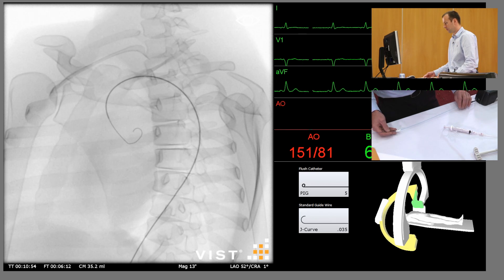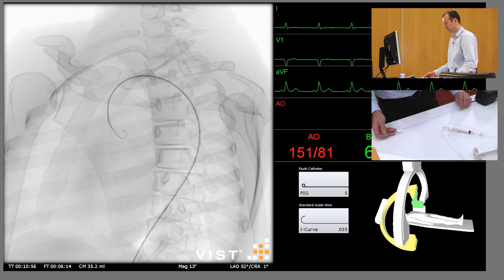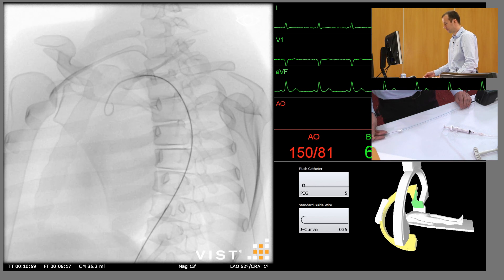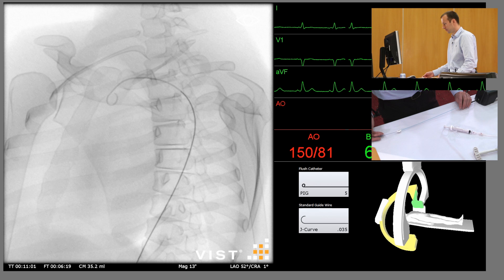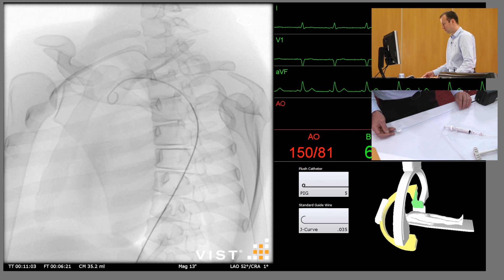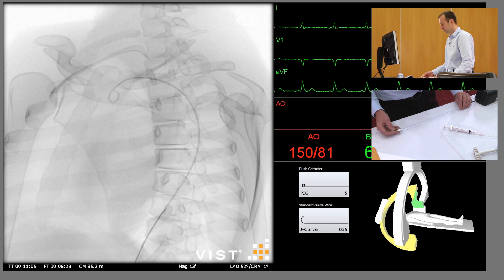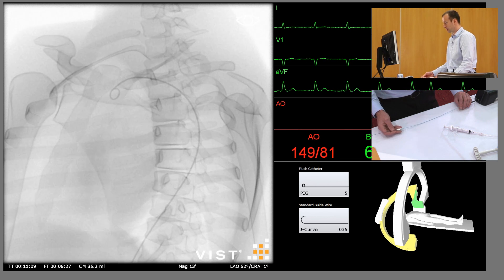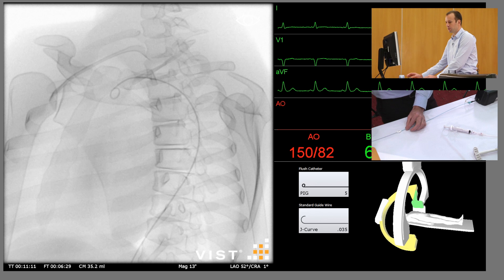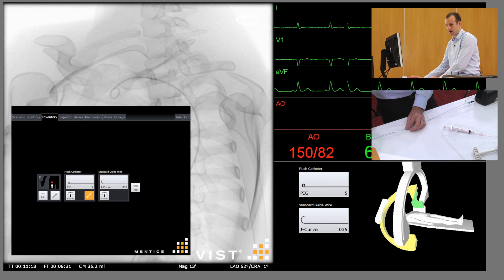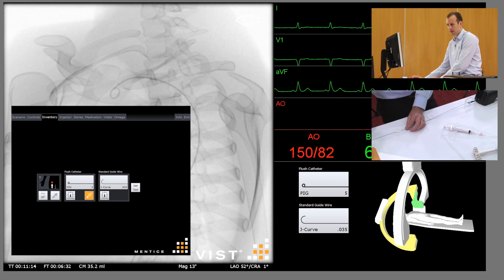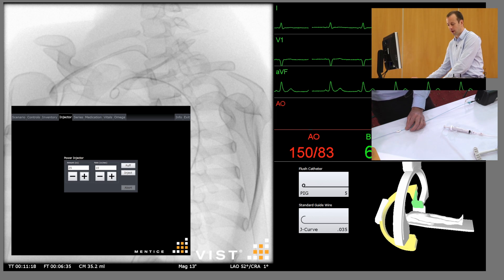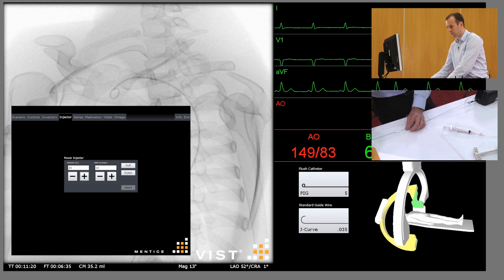We'll advance the pigtail past the vessels, withdraw the catheter, and position the pigtail just past the apex of the arch. Remove the guide wire, and then we're going to do a subtracted angiogram with a power injection of 25 mils of contrast at 10 mils a second.